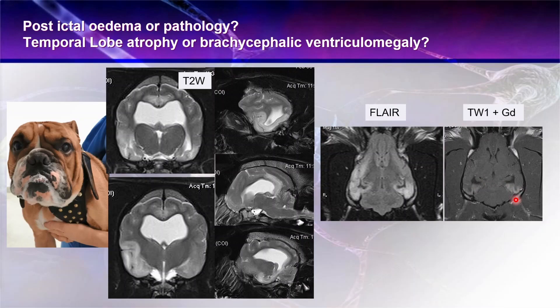So is this temporal lobe atrophy due to him having big ventricles and being a brachycephalic dog, or is there some sort of pathology going on? The answer is probably that there is pathology — this dog likely has limbic encephalitis because there is really quite marked contrast uptake. We wouldn't expect that marked contrast uptake as a postictal effect, although you can sometimes get contrast enhancement there. So it's not an absolute.